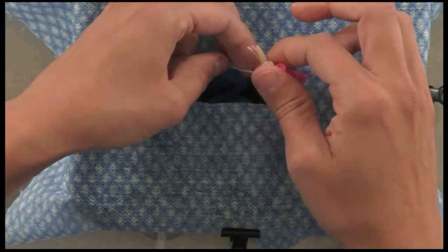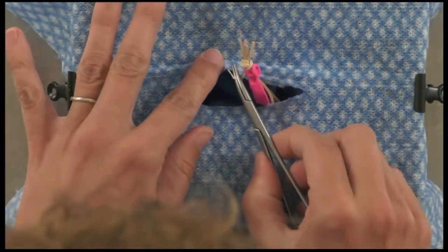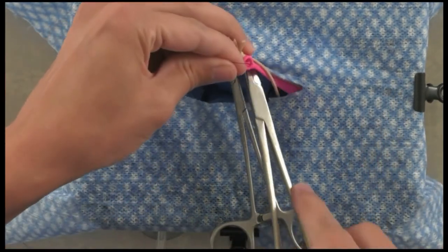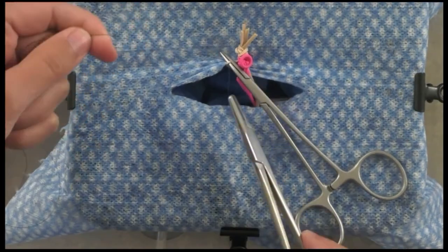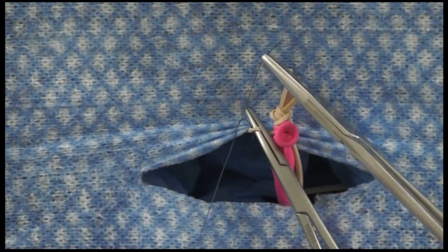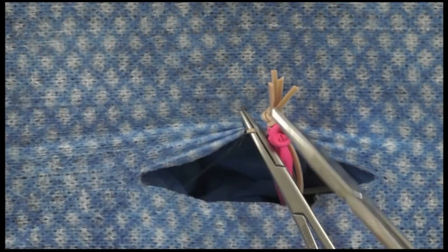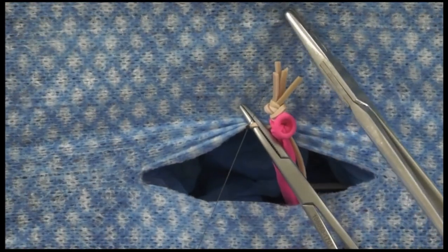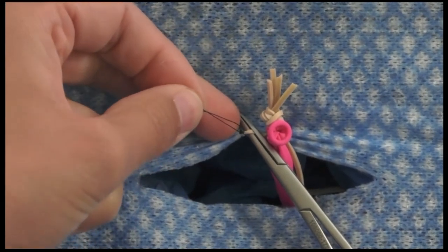The next rubber band going down — which should be kind of loose — represents the ovarian vessels. Use a hemostat or chip clip to clamp across there, then apply two ligatures. For a cat spay, two circumferential ligatures are sufficient. Remember to throw at least four throws creating two knots, then cut your suture ends leaving at least three millimeters — though more is generally preferred.